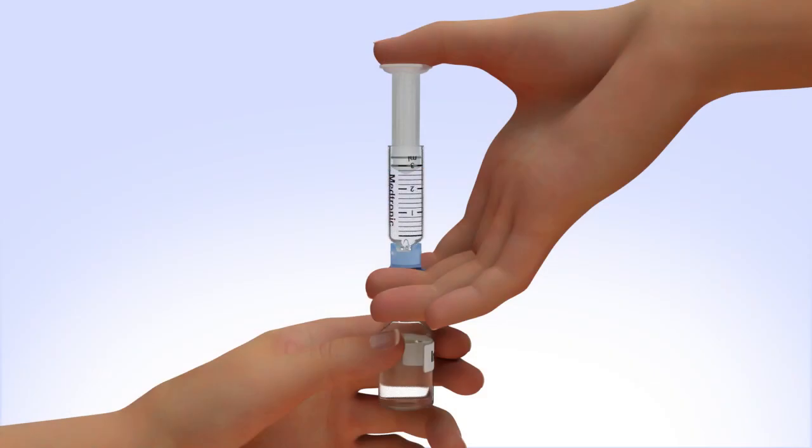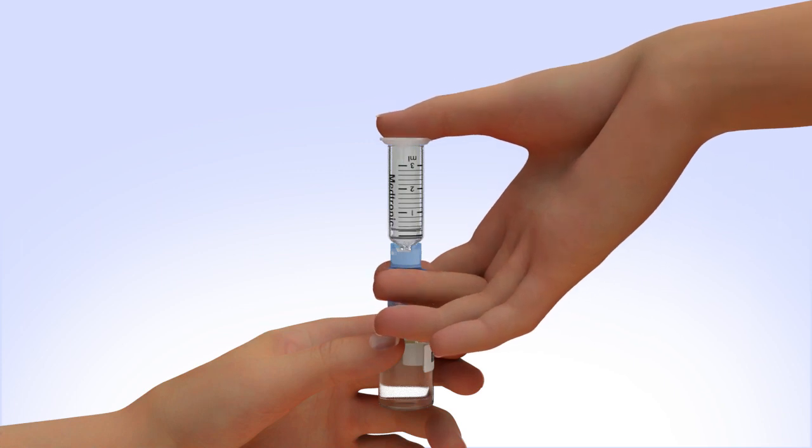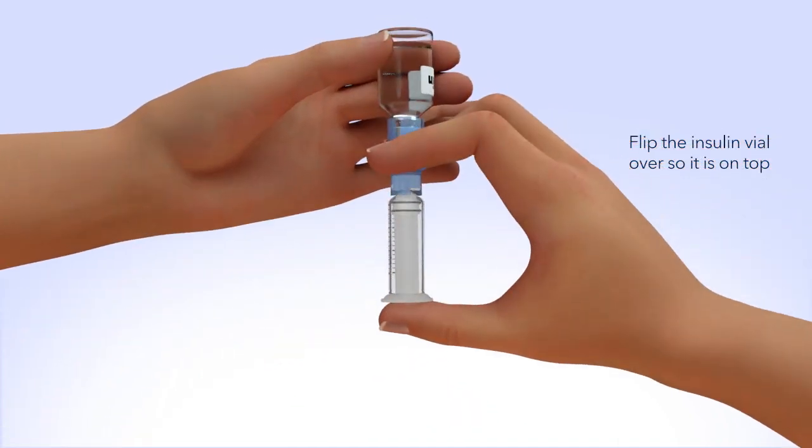Keep the insulin vial upright, place your thumb on the plunger, and firmly push the air from the reservoir into the insulin vial. Holding the plunger with your thumb, flip the insulin vial over so it is on top. Make sure you are holding the vial with your other hand.